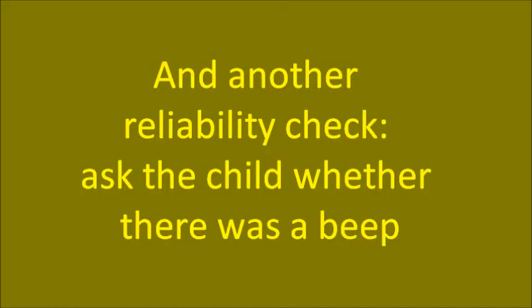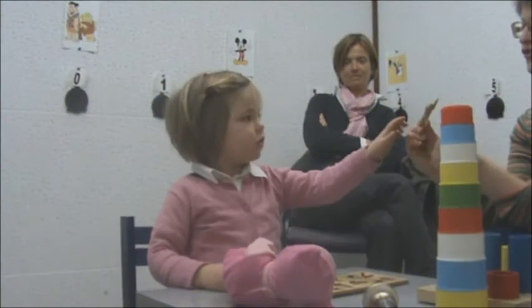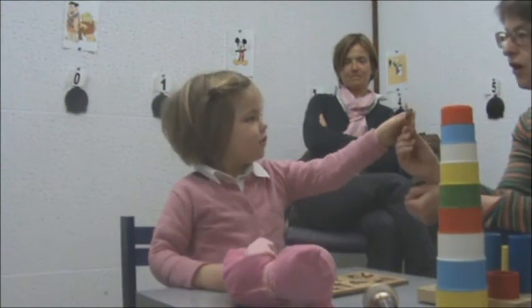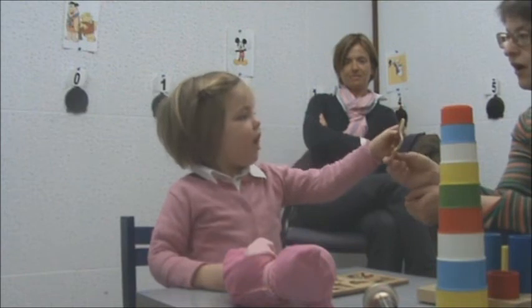To check whether Emily is able to give reliable answers, the testers introduce a negative check here. Some children are very reliable when asked whether they heard a beep. It's quite obvious that Emily's verbal answers are not reliable, and that it's a better idea to rely on her gaze and head turn.